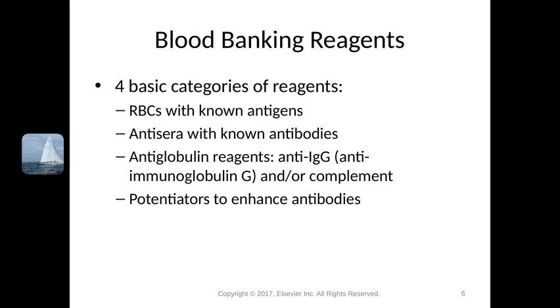So here you want to look at, and don't laugh, red s--t and clear s--t. And, not to joke around or be funny, and yes, I swore on a PowerPoint, but this actually really helps because what we're looking for is the opposite.